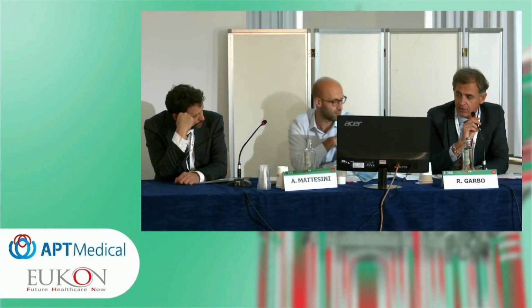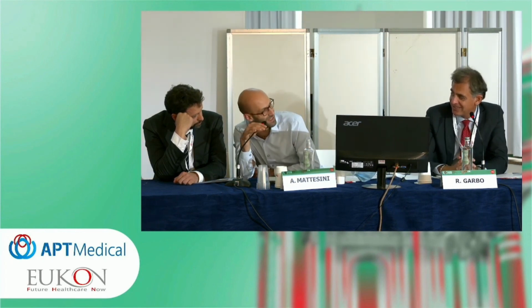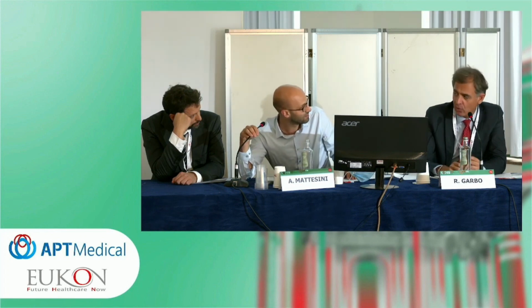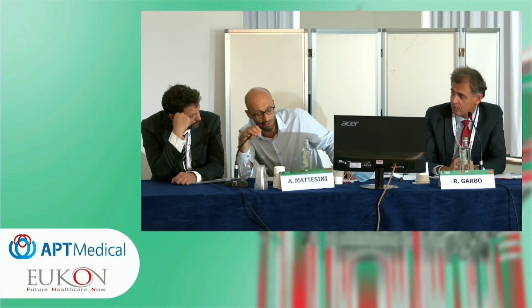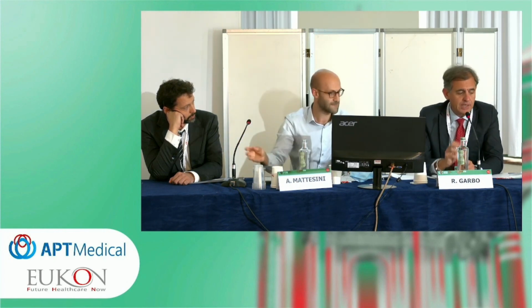Yeah, also because in your case you have many struts inside this. We were very happy to see that this balloon flew through this bifurcation with 3 struts and also the non-deployed stent. And you can perform kissing balloon with 2 spheric balloons? Yeah, you can do it, at least in a 7 French we did it with no problems. To be honest, I'm not familiar with the size. I don't know if, for example, with 3.5, you can go in a 6 French. Okay, thank you very much.